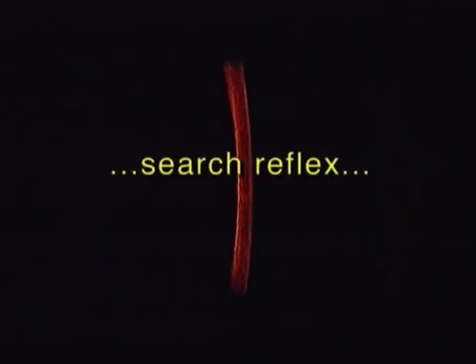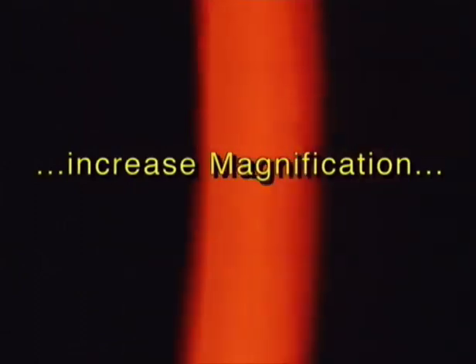For example, for examining the endothelium, we start with a narrow slit and a narrow angle of illumination, and search the focus at the slit at the posterior surface of the cornea. Then, with the angle of illumination increased, we search the specular reflex at the posterior surface. We widen the slit, and finally we increase magnification. Fine adjustments of the illumination angle may be necessary until the endothelium appears, and the polygonal outlines of the endothelial cells can be made out.